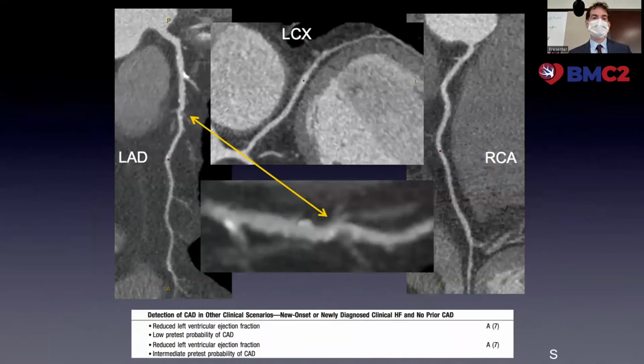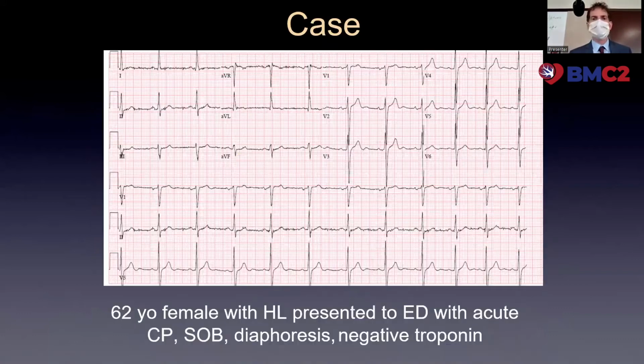So we did a coronary CT. What we found is his coronary arteries looked sort of okay. He has an intermediate amount of plaque in his LAD, but the remainder of his arteries didn't have anything. We medically managed him, and he's done well over the years. So CT can be very appropriate in assessing patients with reduced left ventricular function.